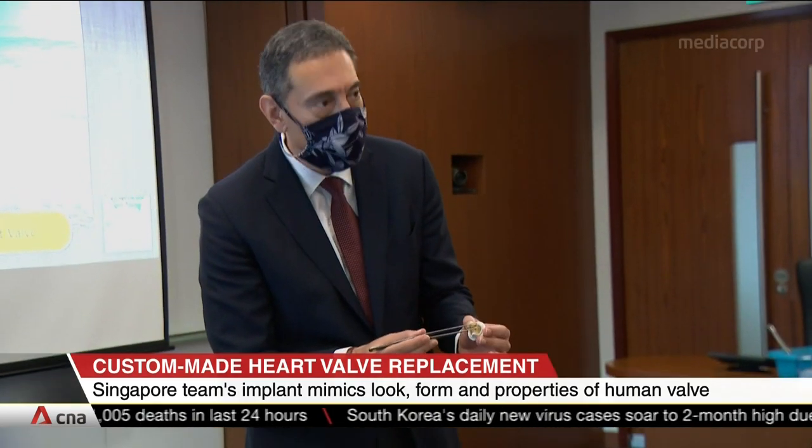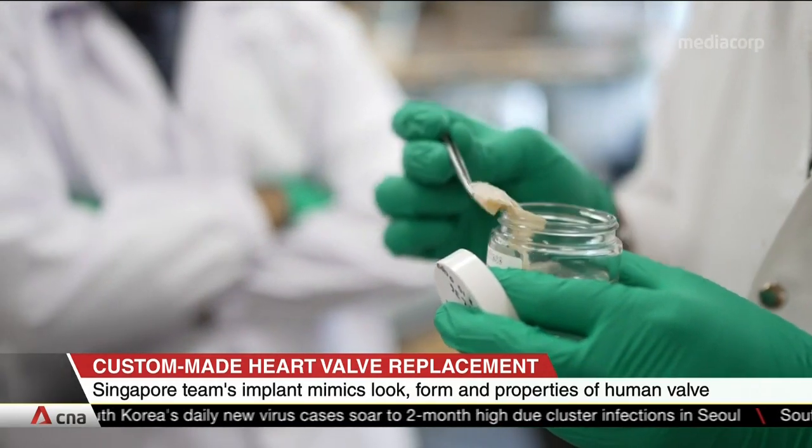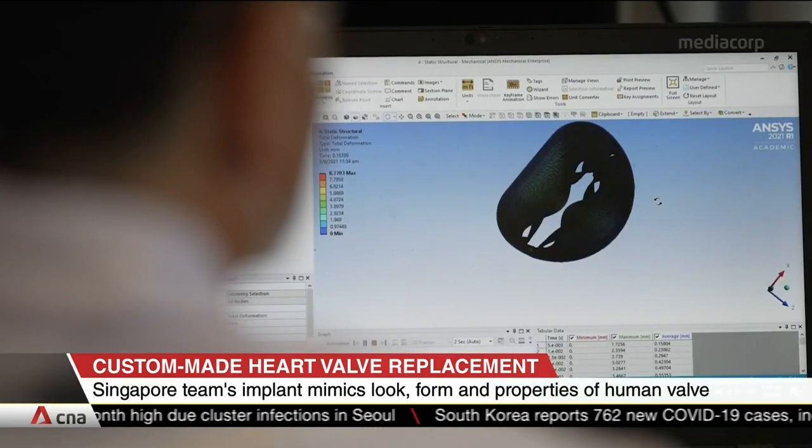Unlike current implants, it's more flexible, less stressful on the heart, and does away with stents that might cause infections. It also may fit individual anatomies.